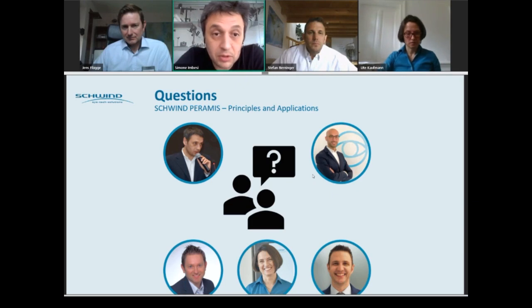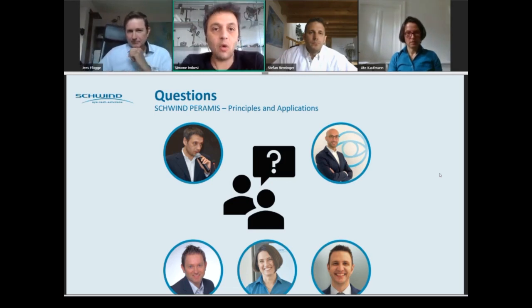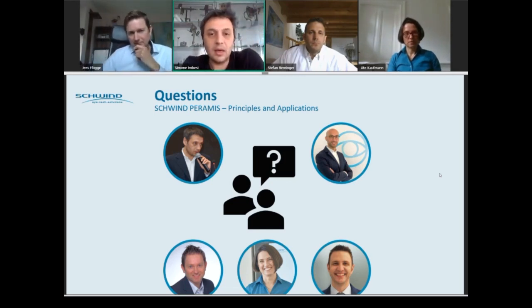chin rest, because the eye orients in the direction of the fixation point. The patient is asked to fix a light optically projected from infinity, so it doesn't matter what the position of the chin rest is. The eye always looks along the axis of the device.